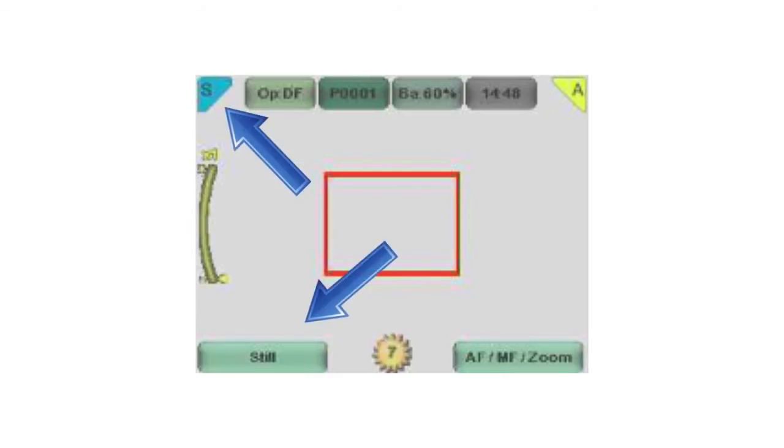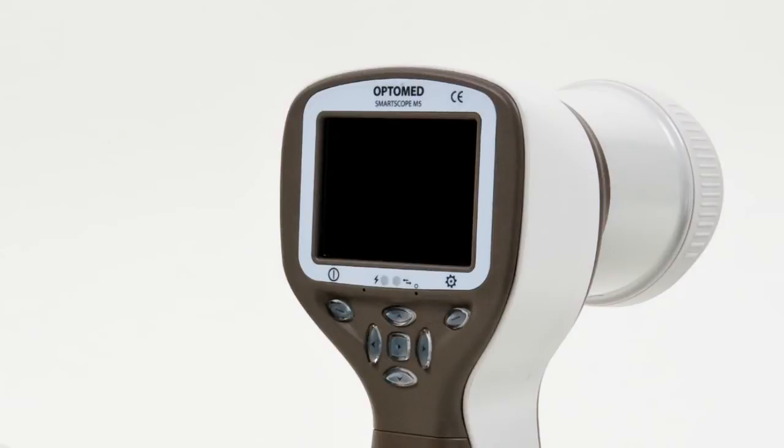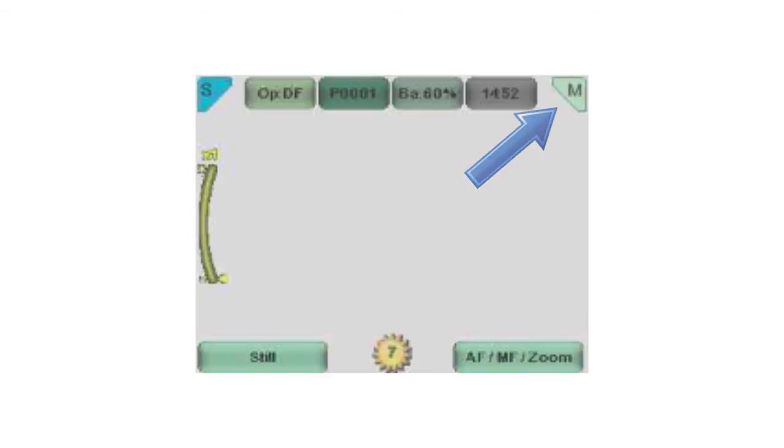The icon on the bottom left of the screen indicates which capture mode is active. For focus mode, select the focus mode by pressing the right soft key — the icon in the top right corner of the screen indicates the selection. A is for autofocus and M stands for manual focus. When using manual focus, you can adjust the focus range by pressing the arrow keys up and down.